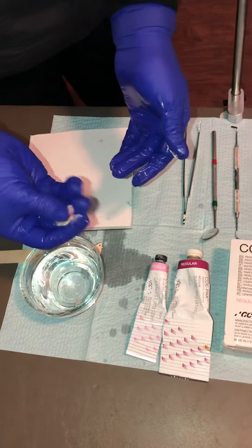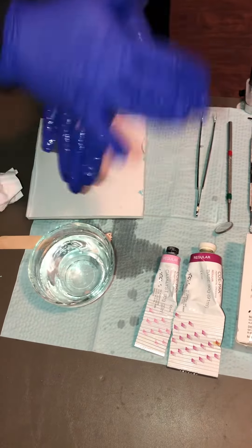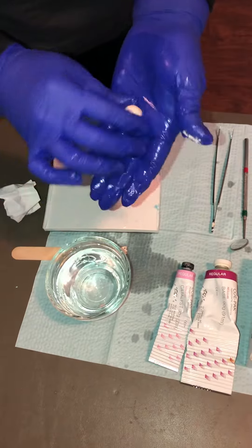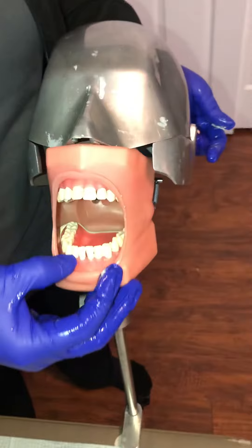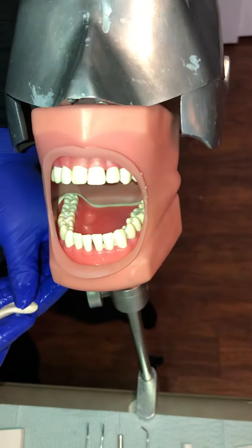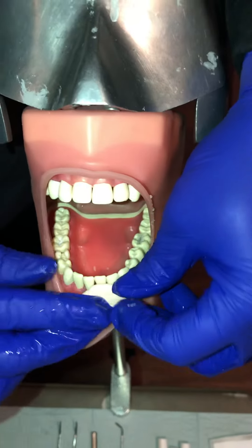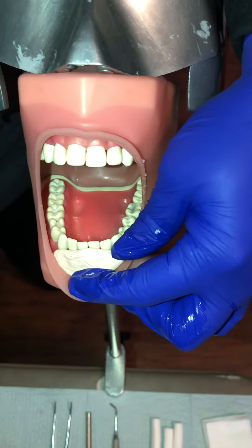Now it's set enough that I'm going to roll it into a ball. You can re-dampen your hands if you need to. I'm going to place it from canine to canine, like in the video — I had some lower sutures placed. So flatten it out to the length of the area, canine to canine.